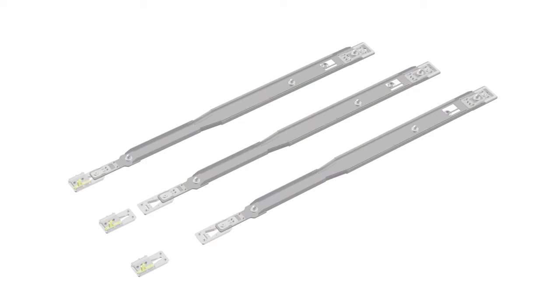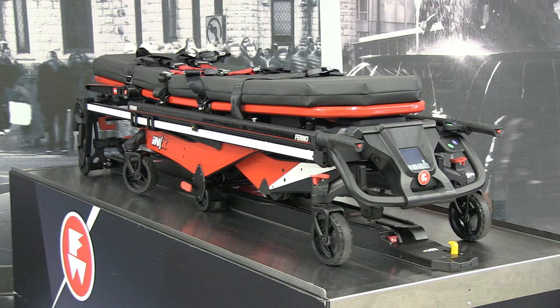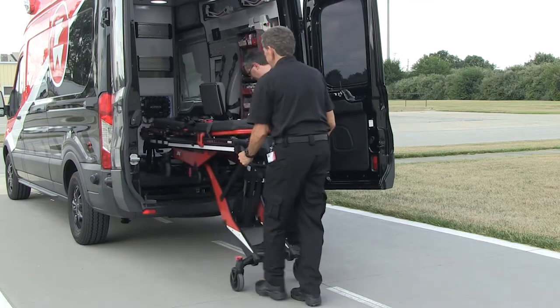There are three lengths available of the inline fastening system: inline short, inline medium, and inline long. All are compatible with the FERNO NX patient transport and loading system. The length of the inline fastening system is dependent on the size of your vehicle.